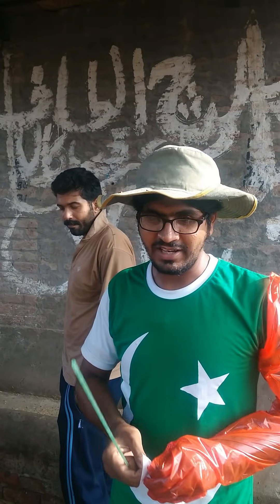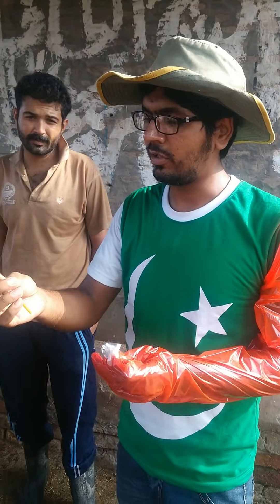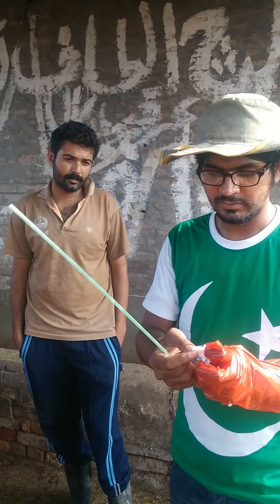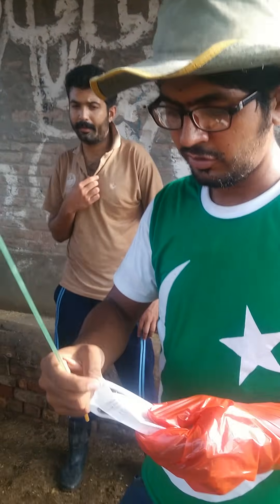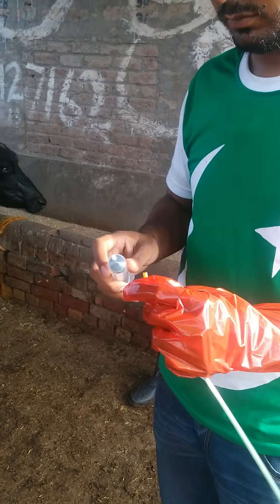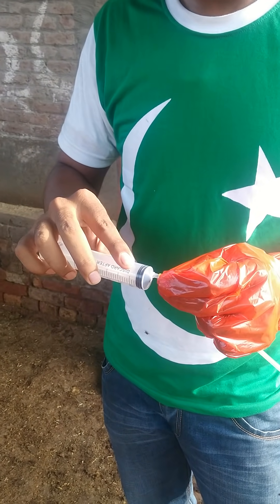So in that case, I would like to tell you how to take it. This is an AI rod — it has a connector and this is a 30ml syringe just to push the material out.